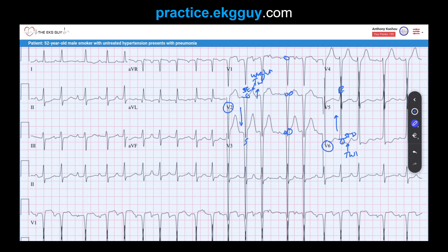ST segment depression of 1 mm or greater in leads I, V5, and V6 could suggest ischemic changes in the presence of LVH. We chose not to diagnose ischemic ST-T changes here — the ST depression in V5 and V6 is present but the LVH voltages are so great that, given the clinical context, the hypertrophied left ventricle appears to be the primary contributor.